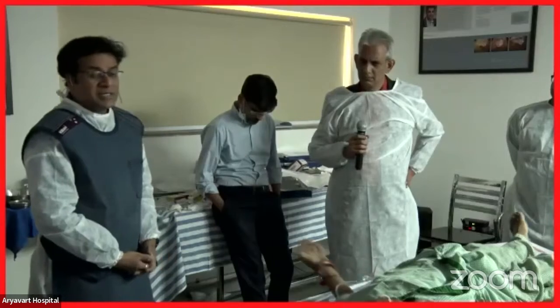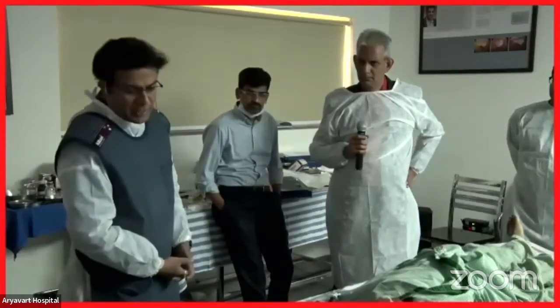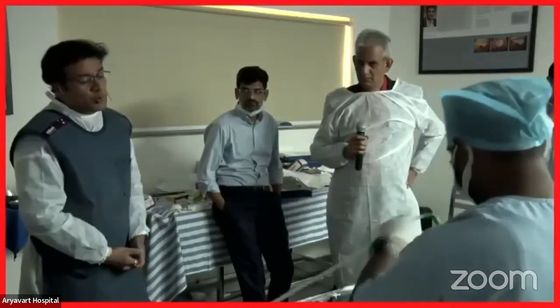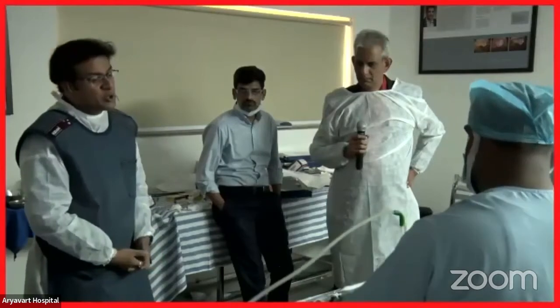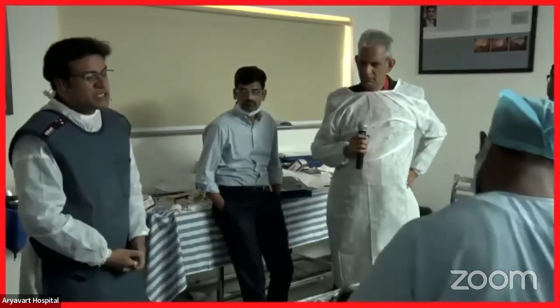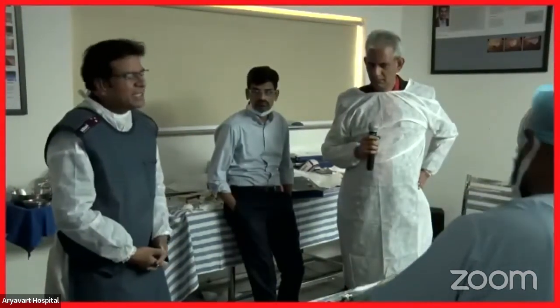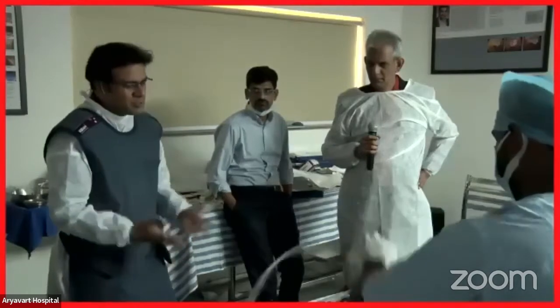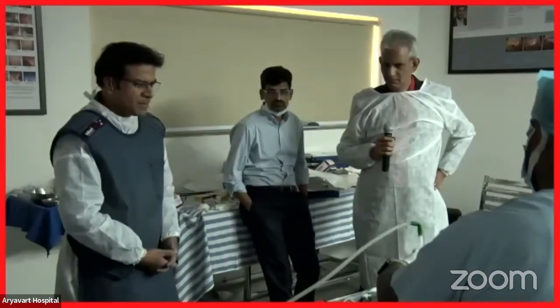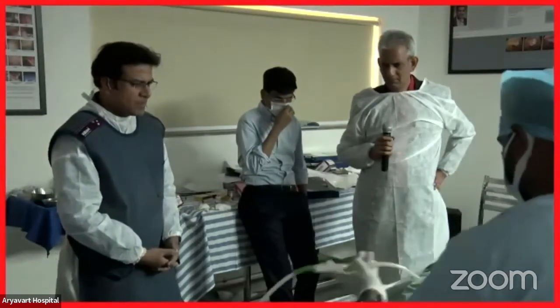I think the tube that we used looks very thin, maybe just 7 French or so, and unfortunately we couldn't see this tube. But usually in the jejunum on EUS, you are able to locate the tube as well, so that becomes very convincing. Moreover, when you instill fluid, if you can see the fluid immediately crossing that structure, it cannot be a colon; it has to be a small bowel. That's the usual logic we use. If you find the tube, there is no need to worry, and mostly you should be able to locate the tube.